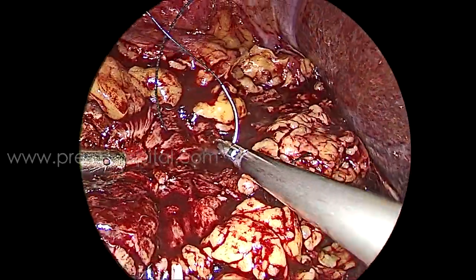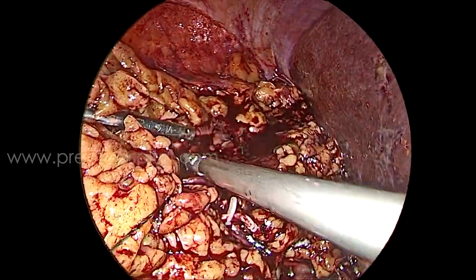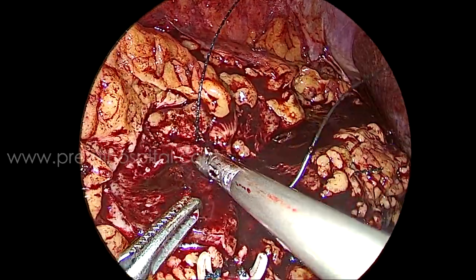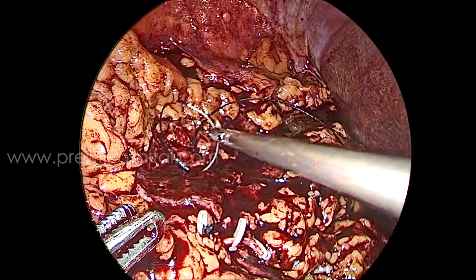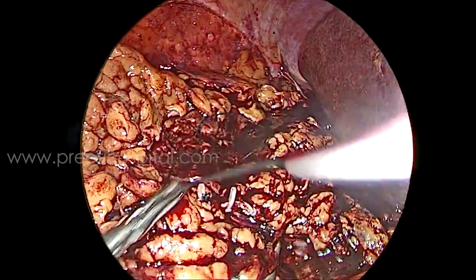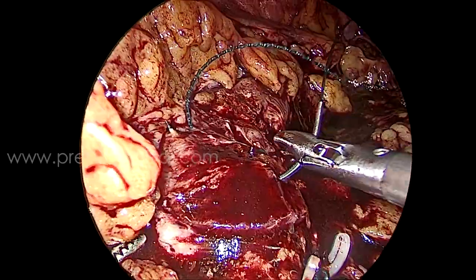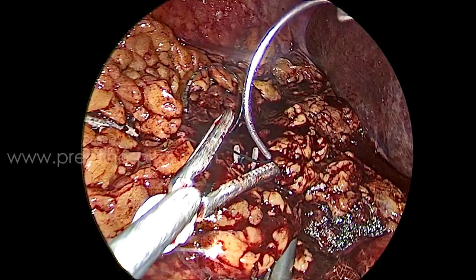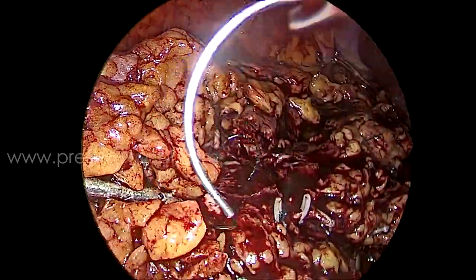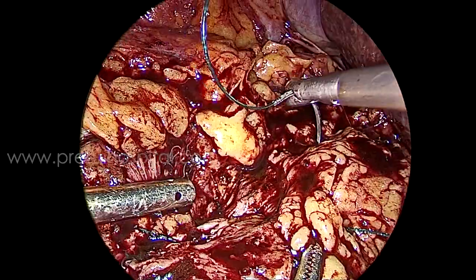The entire idea is that when there is a lot of fat, ooze will be there and a clear field will not be there. Suction is very important — if you suction every drop, only then it is good. Until the last level it is sutured, then the clamp is applied, removed, and we come to the outer renorrhaphy.